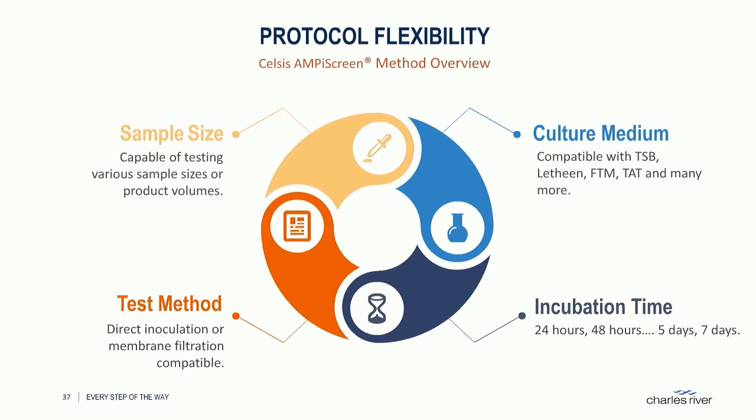And then the incubation time, again, based on what type of assay we're doing, sterility, maybe a sterility screen, in which case that real-time result is very important, or microlimits test. We could look at different incubation times to be able to validate that the test provides the results that are required within a particular time frame.